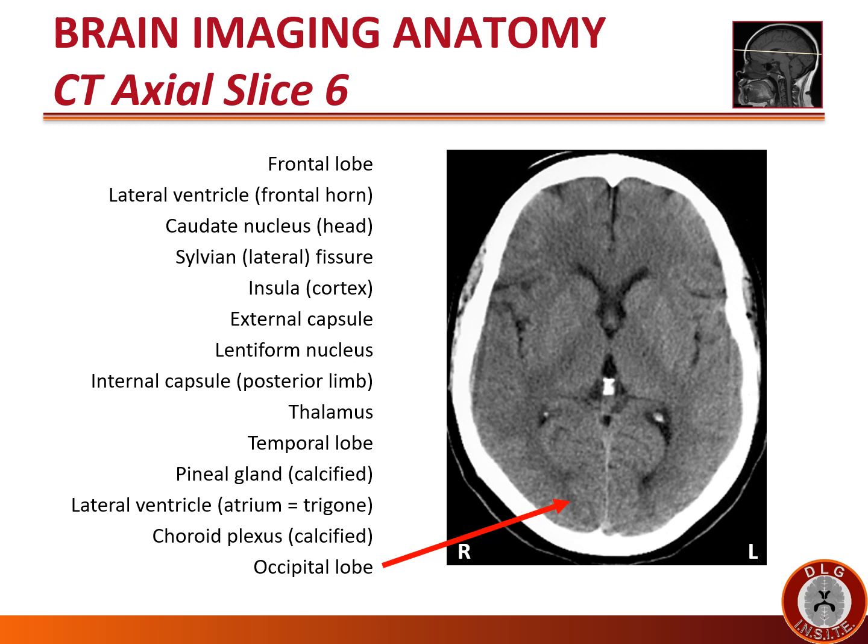Dorsally in this image we see the occipital lobe. Note that there is a falx or hyperdense line between the two cerebral hemispheres throughout the posterior aspect of this image. Therefore we are now above the cerebellum and in occipital lobe. We are not yet above the occipital lobe because we still see temporal lobe — at the levels you see temporal lobe, the posterior aspect of the brain will be occipital lobe.